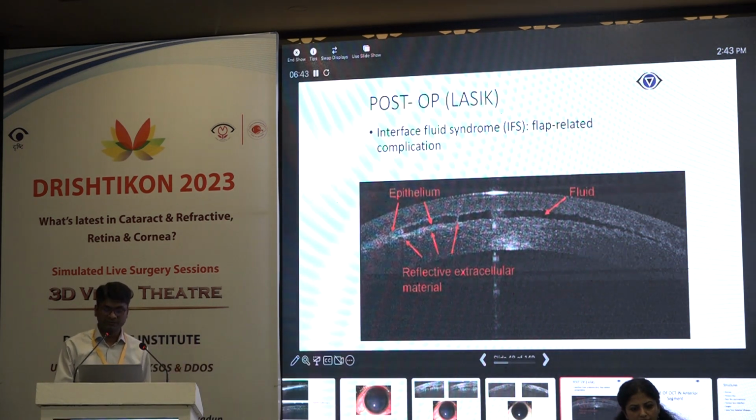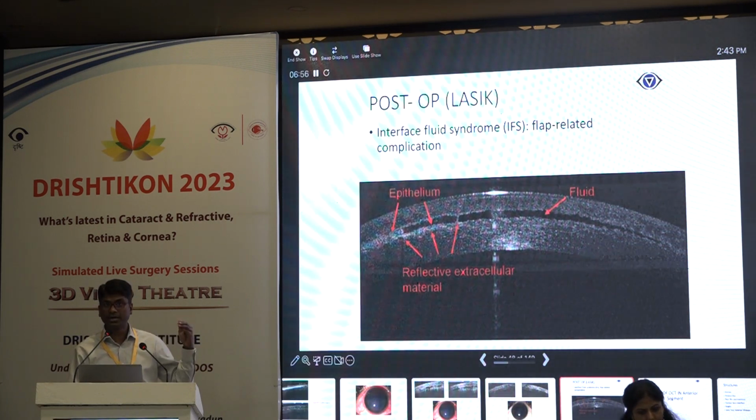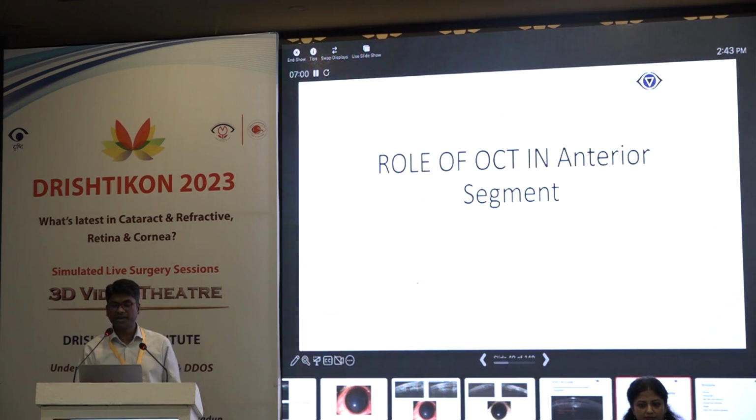Before that, this is a very good friend of mine. He said, Vikas, can you have a look? And when we saw, there was fluid in the interface on OCT, and the pressures were 35. So this was actually a steroid responder, and this was the only area from where the fluid could accumulate. We stopped his steroids, gave Diamox, and he was perfectly fine.